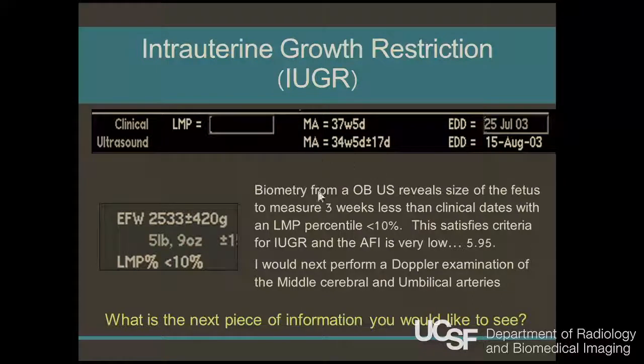So if you see a case like this and you're hovering on the borderline, I would just have caution to say that this 9.5 extra millimeters of fluid is not implying that this baby is any safer than it was if that 9.5 millimeters of fluid wasn't there. So basically you're hovering around the range of oligohydramnios.